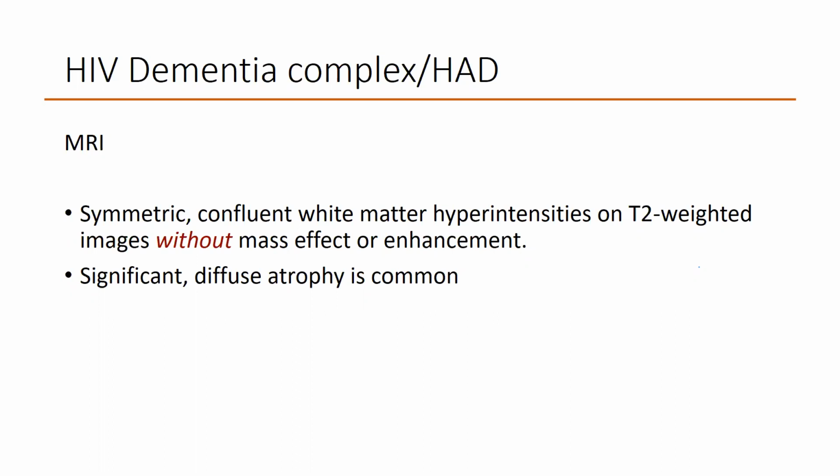You start the patient on HIV treatment, and then you do the MRI, and there is contrast enhancement. So what you said initially is correct. IRIS. Enhancement is there, blood-brain barrier, should be PML. PML IRIS.